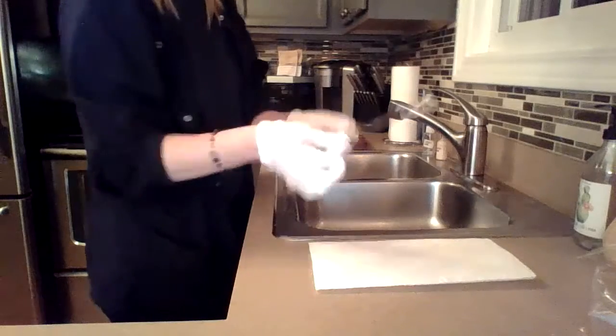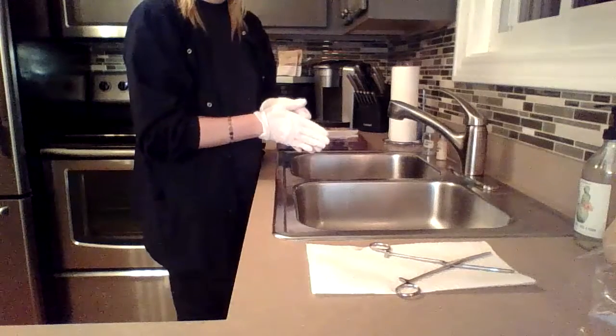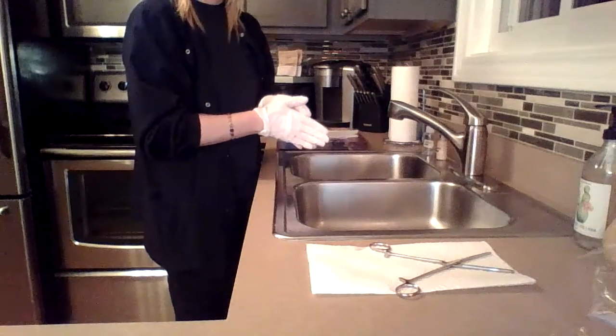Once I have it nice and clean, I'm going to place it on the dry station completely open so that it can go ahead and air dry completely before we move on to the next step.